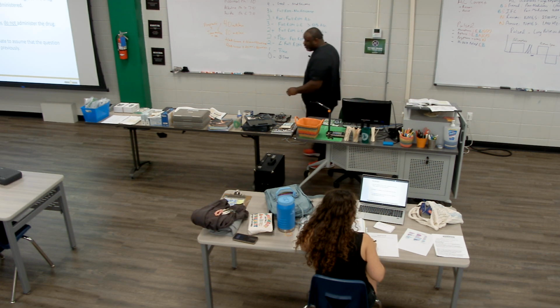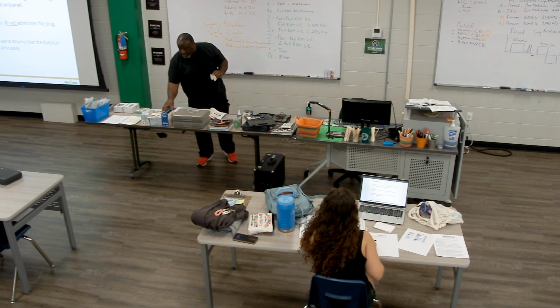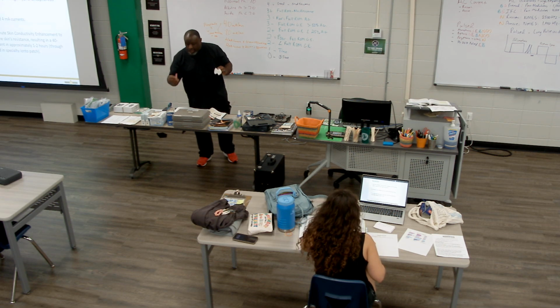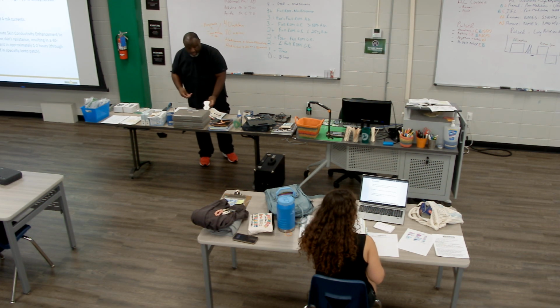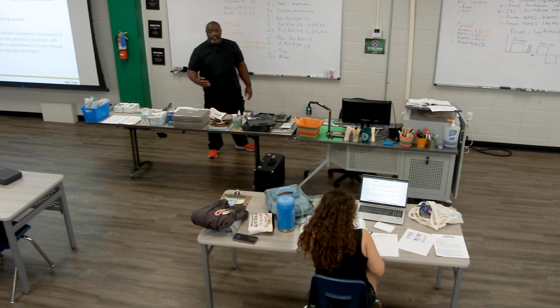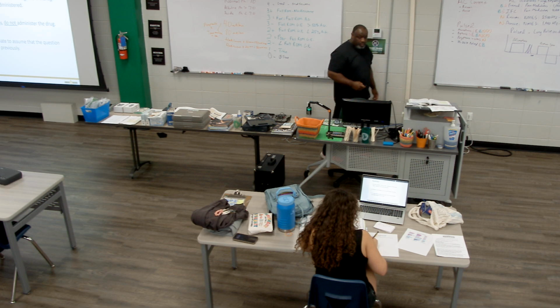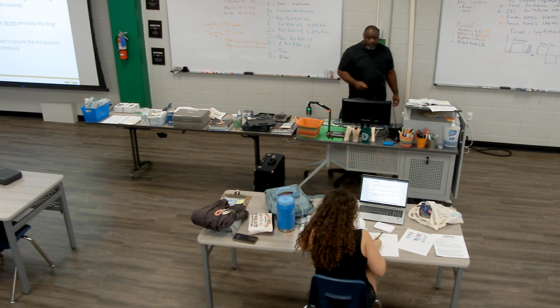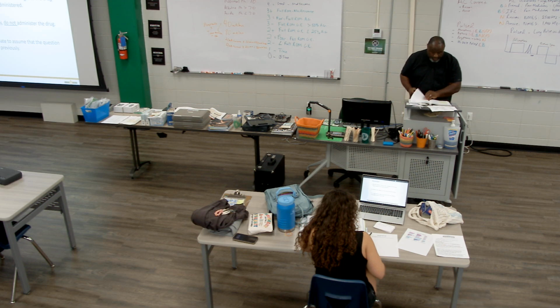On these, it'll be medication on one, and then we'll talk about the other. There's saline that goes on the other side. It comes with these saline drips that you peel the top off and put it on the opposite side. So you want to talk to them about any medications or allergies that they may have, because that could be dangerous. Okay? So, always ask.